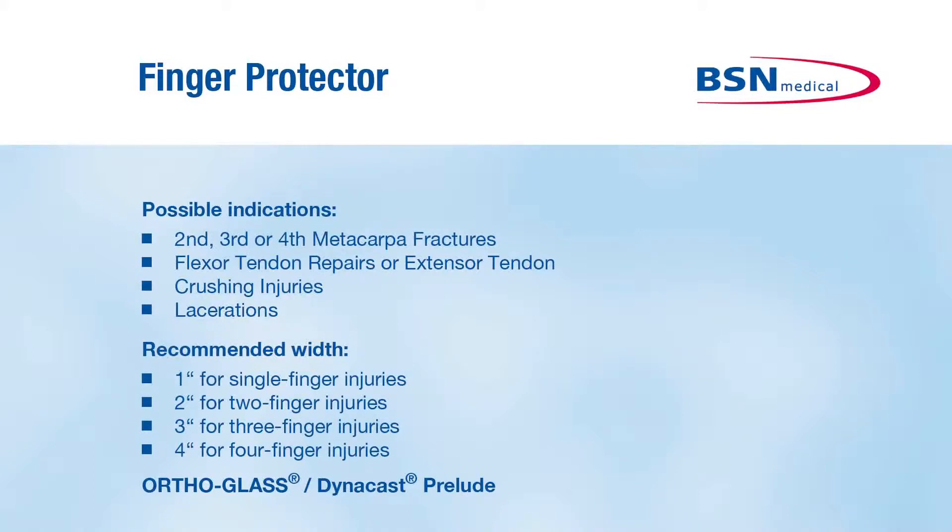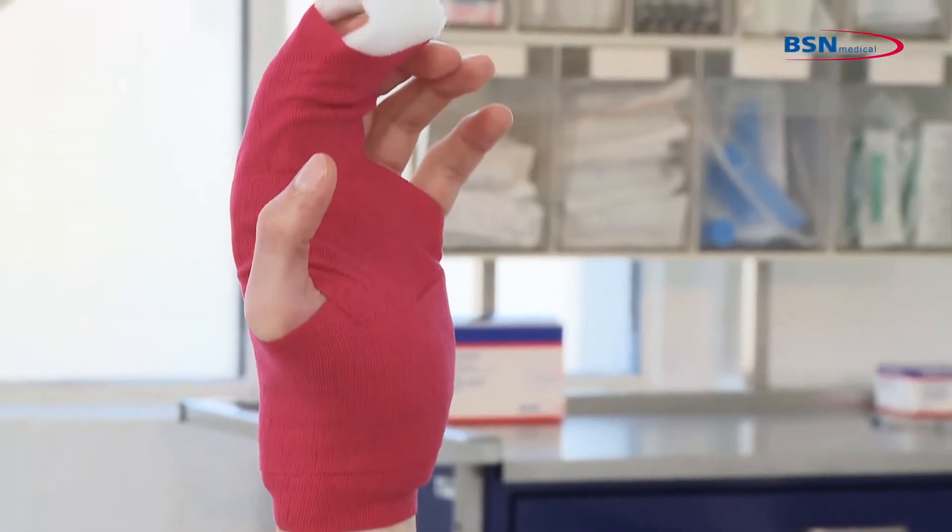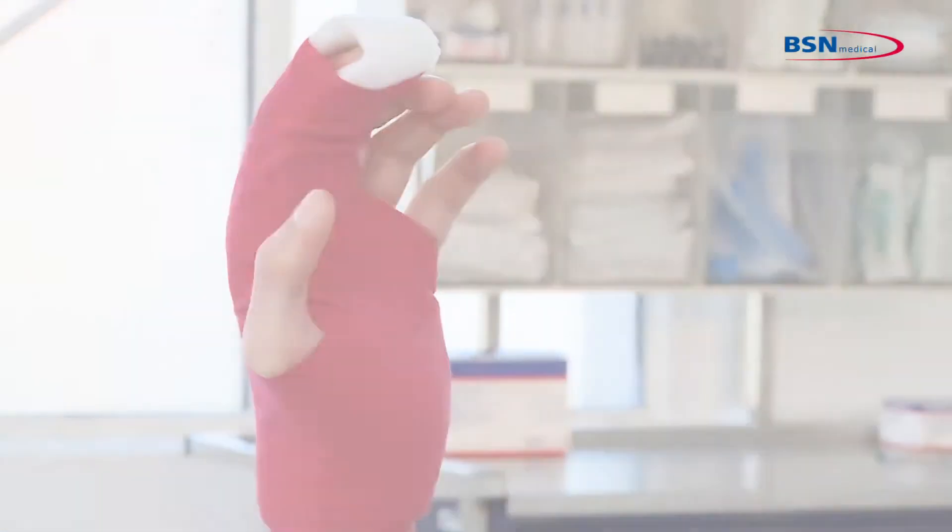The finger protector can be used for second, third, or fourth metacarpal fractures, flexor tendon repairs or extensor tendon crushing injuries and lacerations.